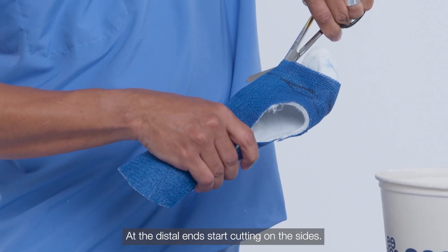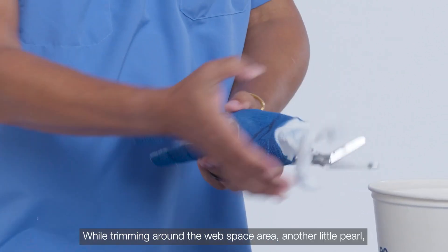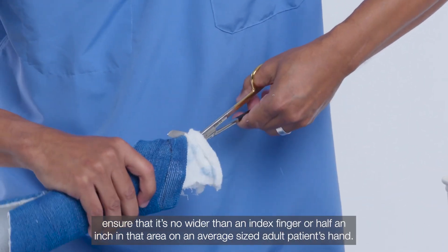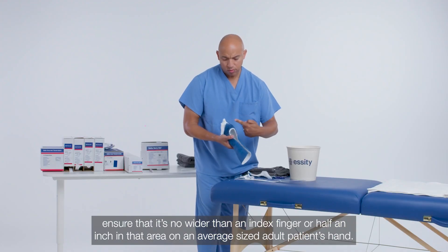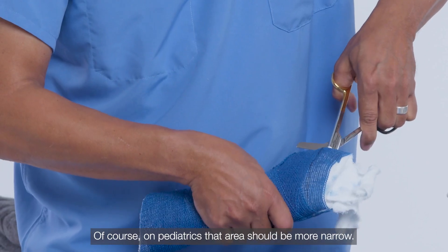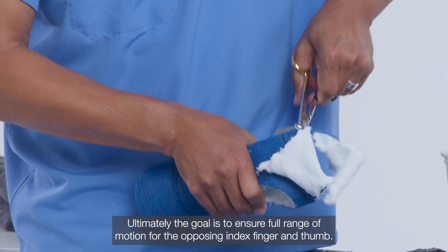At the distal ends, start cutting on the sides. While trimming around the web space area, another pearl: ensure that it's no wider than an index finger or half an inch in that area on an average-sized adult patient's hand. On pediatrics, that area should be more narrow. Ultimately, the goal is to ensure full range of motion for the opposing index finger and thumb.